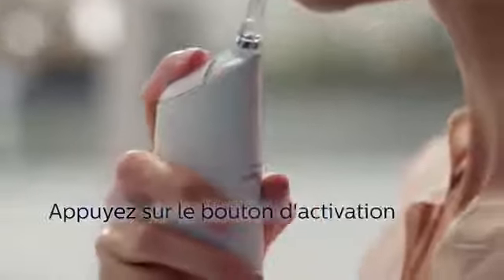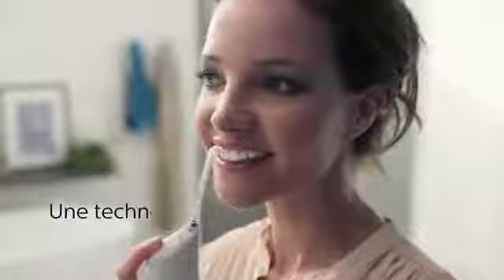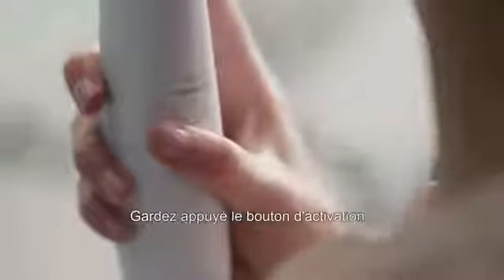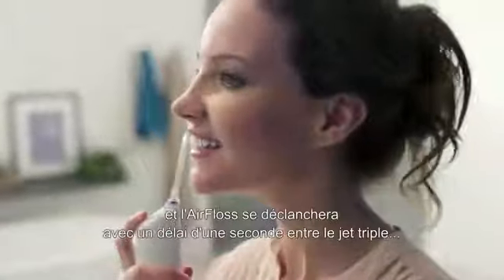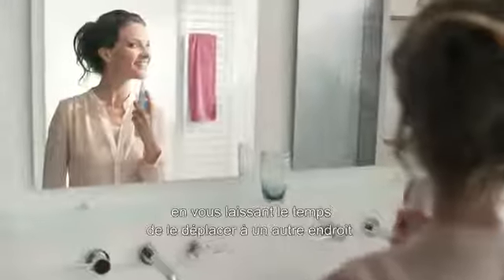Press the activation button to deliver a gentle yet powerful triple burst of micro droplets between your teeth. Hold down the activation button and the Philips Sonicare AirFloss Ultra will auto-fire with a one-second delay between the triple burst, giving you the time to move to the next space.